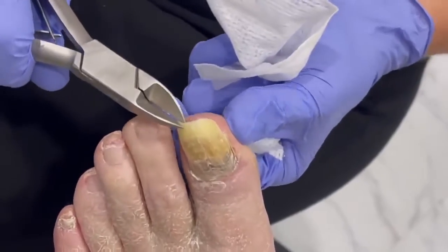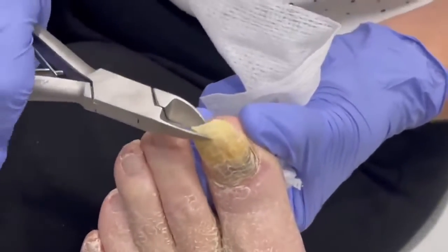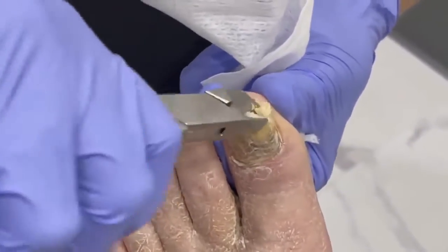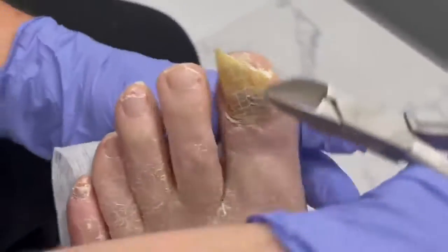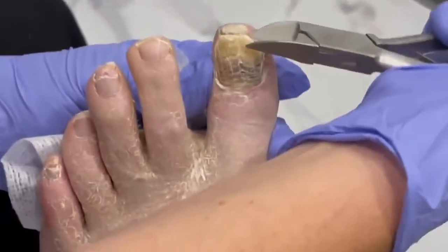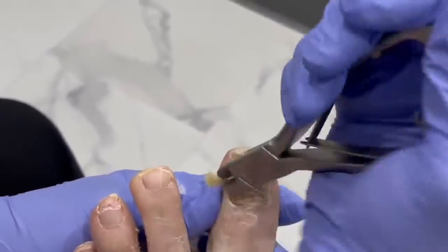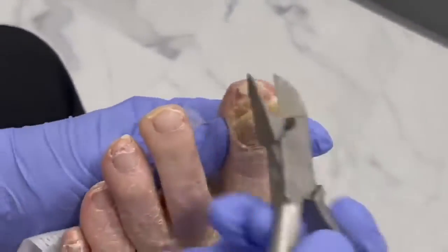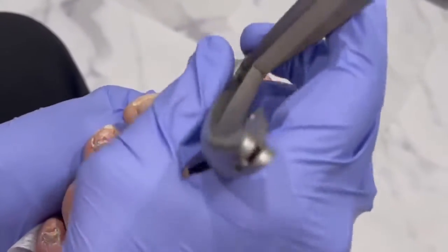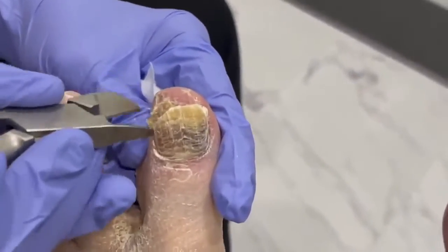It's really loose too — look at that. It's really only attached at a small little section down there, so I'm gonna be able to take this one almost all the way off. Just the nail — you can keep the toe, I don't want it. You're welcome! All of that skin really just builds up in there — it's debris and skin cells, all kinds of fun stuff that we can scrape out.